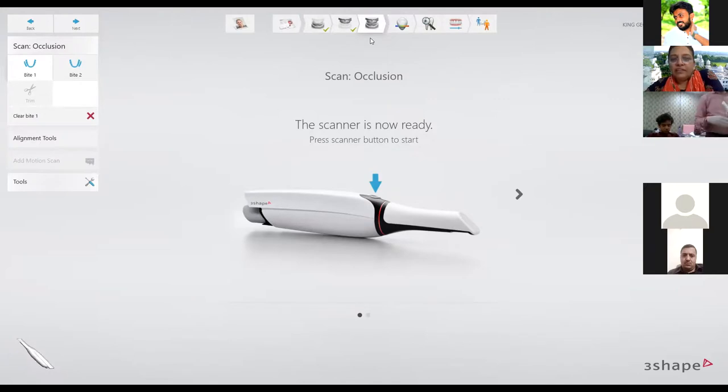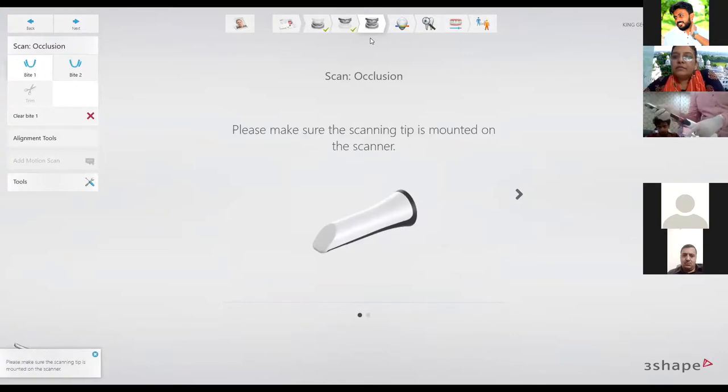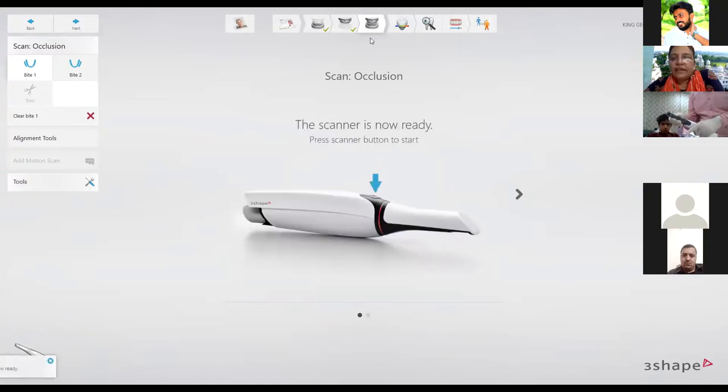Are there special sheets available for the purpose of maintenance of hygiene and prevent cross-infection? No. The scanning sheet will disturb the image quality, so sheets are not preferred. Just that the area has to be disinfected before use on any particular patient. We have four probes available, so this can be changed like this. Another one can be put on if we have two simultaneous patients to be scanned in a single sitting, and one we have to keep for calibration purposes.